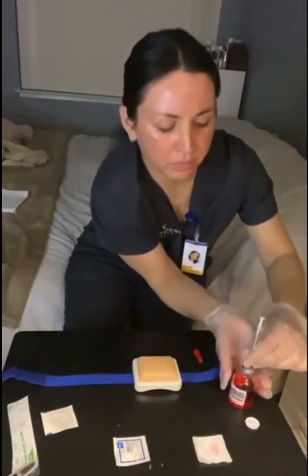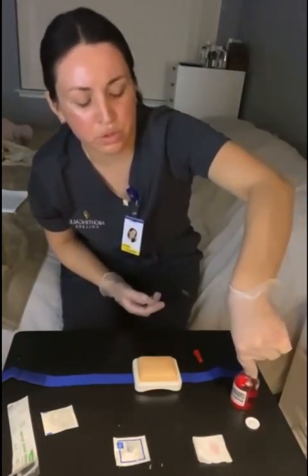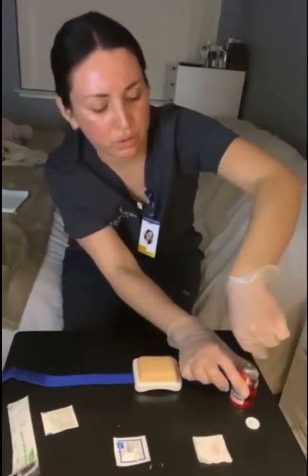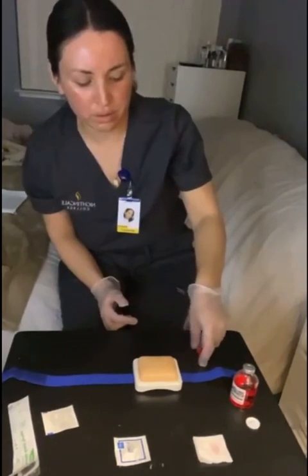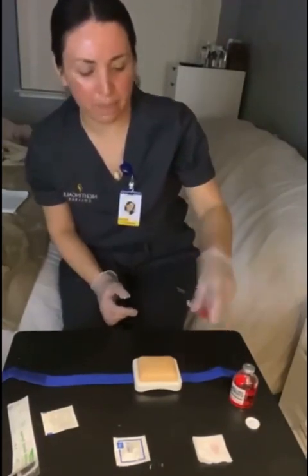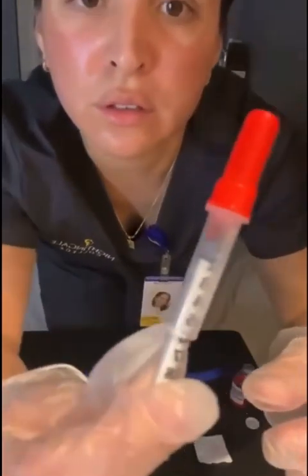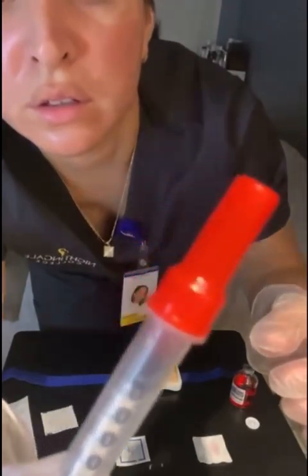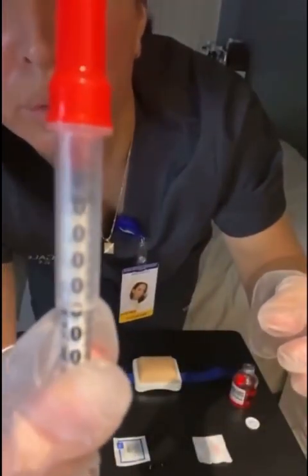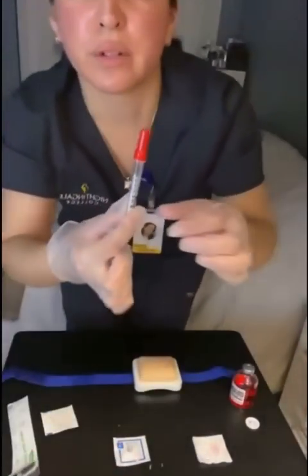Okay. Next, I'm going to use the one-hand method to recap that. And I do want to show you guys it is 0.1. Zero point one. 0.1. Okay.